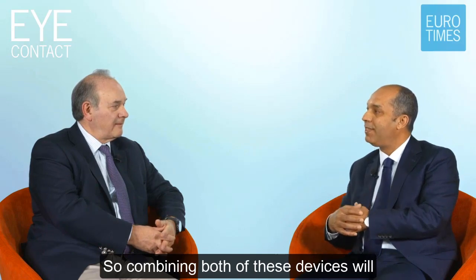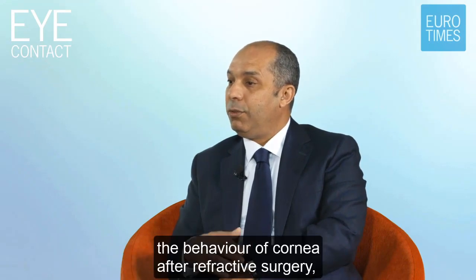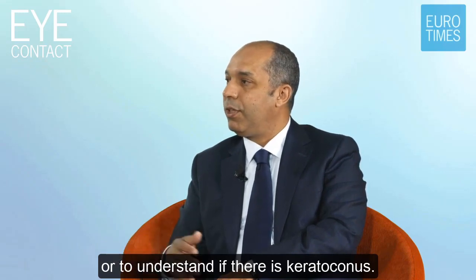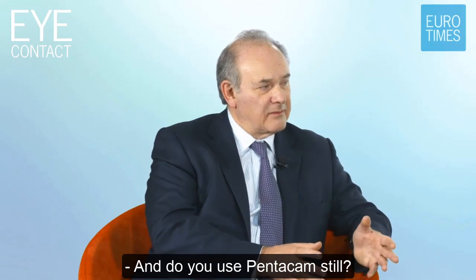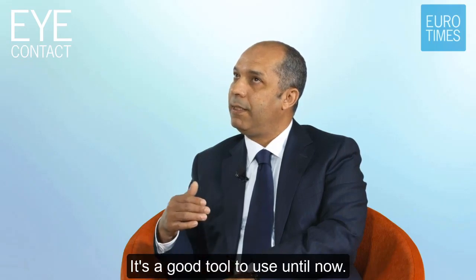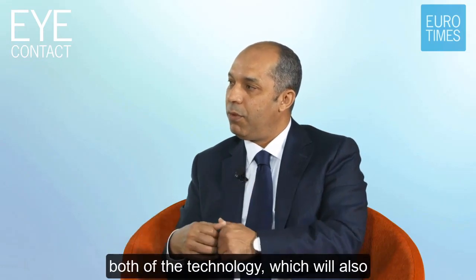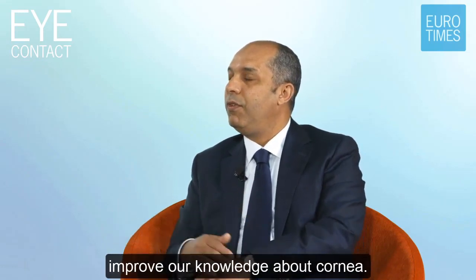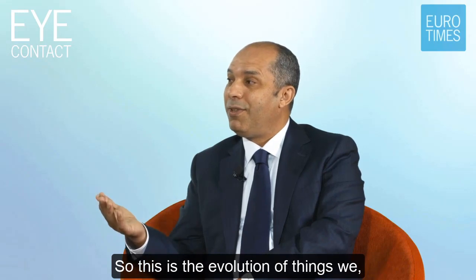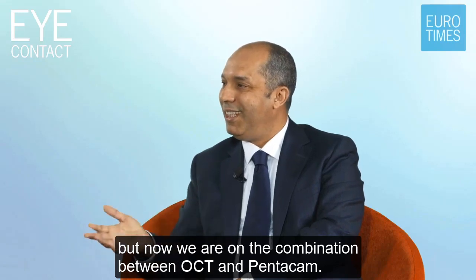So combining both of these devices will give us more information to understand, for example, the behavior of the cornea after refractive surgery, or to understand if there is forme fruste keratoconus. And do you still use Pentacam, or do you think? Yes, we use Pentacam. It's a good tool, and we see that there are now devices combining both technologies, which will also improve our knowledge about the cornea. So this is the evolution of things. As I told, we started with Placido, but now we are on the combination between OCT and Pentacam.